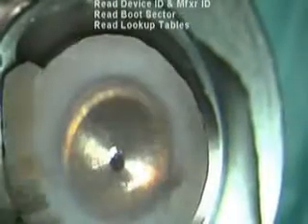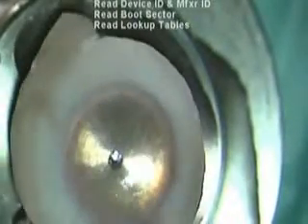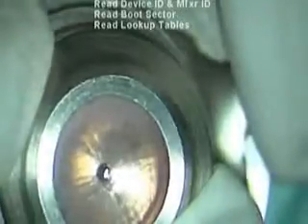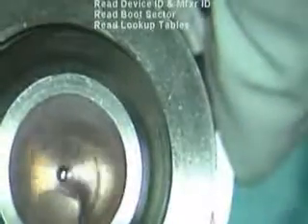The donor material consisted of a corneoscleral button with up to a 3 mm scleral rim. This tissue was mounted on an artificial anterior chamber. The intrachamber pressure was checked before dissection of the donor button, maintaining the pressure by closing the valve or applying the clamps provided with the unit.